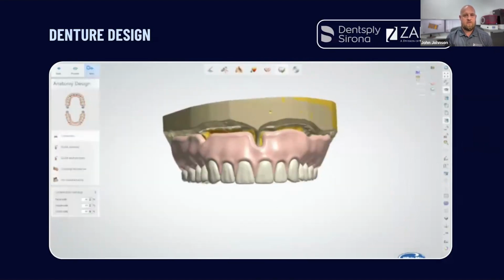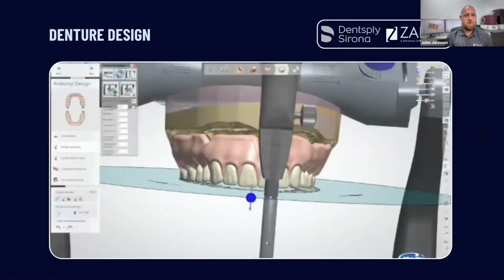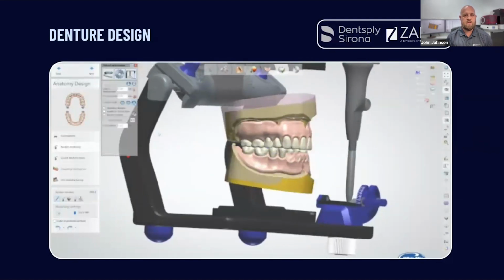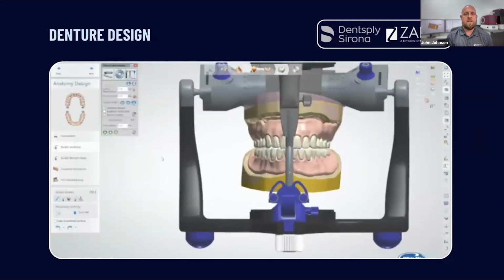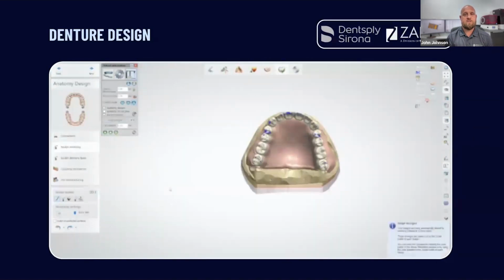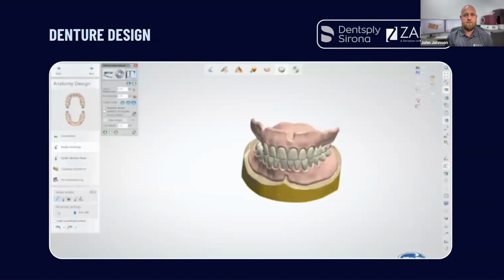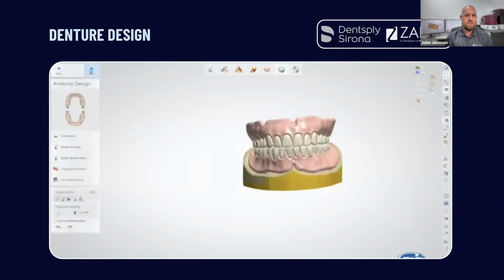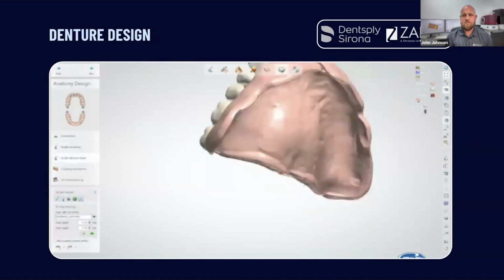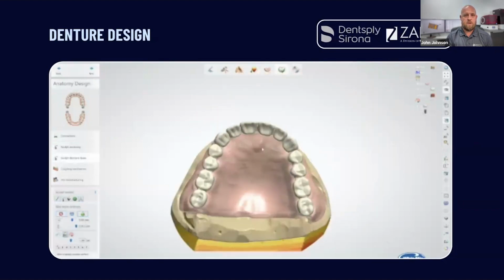Moving past that, you're going to create the bases, and you're going to create them based on minimum thicknesses, and then the computer will generate those bases. Then you're able to manipulate those. That part there, I was showing you how the articulator functions, how you can run through excursive movements, how you can make adjustments. Like I said, this video is a little bit quick just because I want to get through it. There's your denture ID if you wanted to do those.